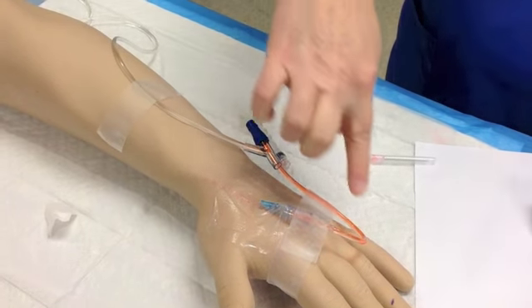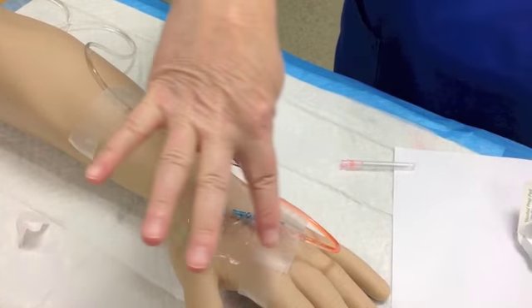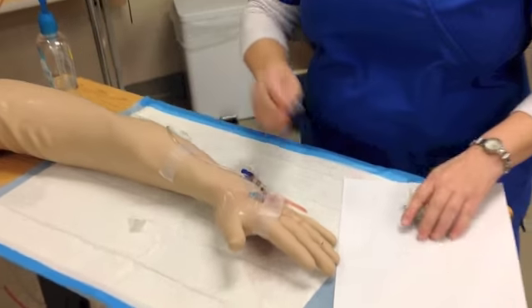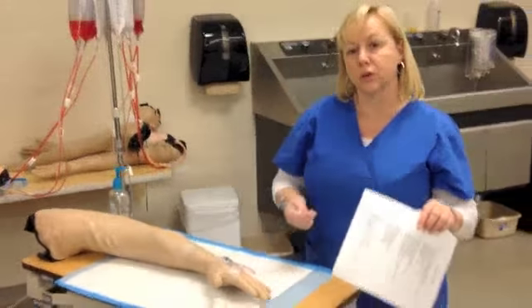So over a period of a few minutes, this is all going to completely run into the patient's vein. And so that's all there is. Clean up your mess, and you're finished with your IV push.